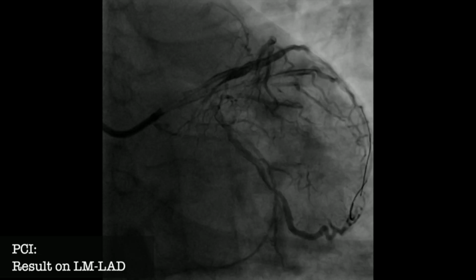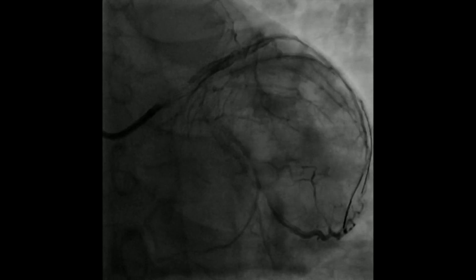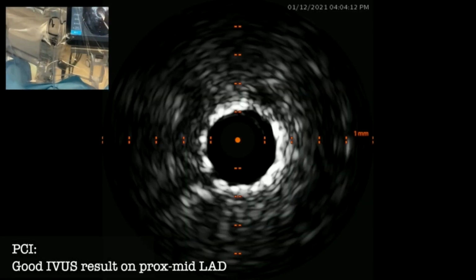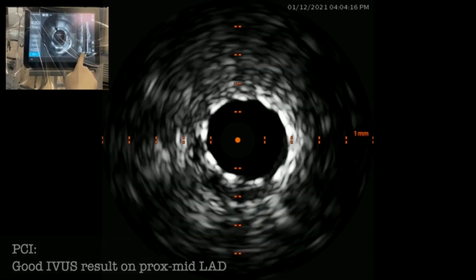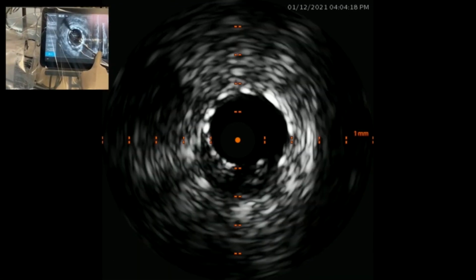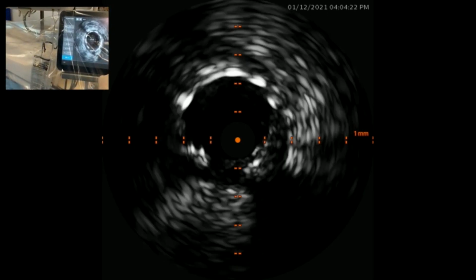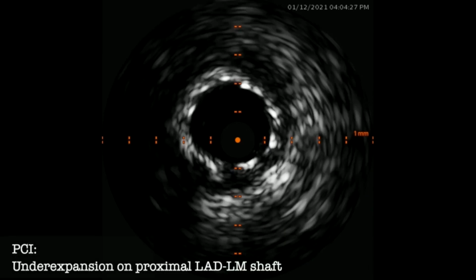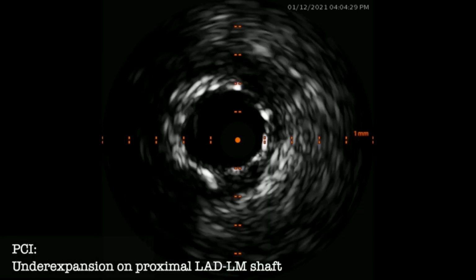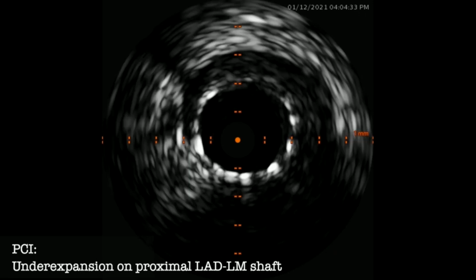This is the stent from the left main with a minimal overlap to the proximal LAD, to the previous stent, and this is the IVUS. The IVUS, of course, should be done in a left main treatment. This is a young patient. We will not get into details of the IVUS analysis because what we will show now is that we, of course, optimize the stent expansion with a 4.0 balloon. And I think you will agree with that.